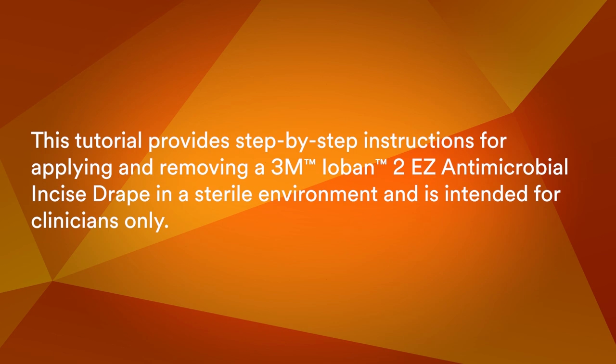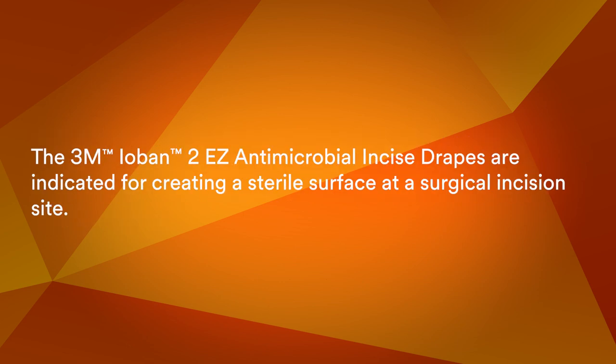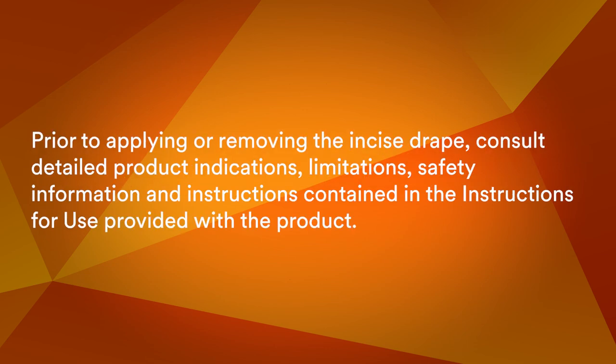This tutorial provides step-by-step instructions for applying and removing a 3M Ioban II Easy Antimicrobial Incise Drape in a sterile environment and is intended for clinicians only. The 3M Ioban II Easy Antimicrobial Incise Drapes are indicated for creating a sterile surface at a surgical incision site. Prior to applying or removing the incise drape, consult detailed product indications, limitations, safety information, and instructions contained in the instructions for use provided with the product.